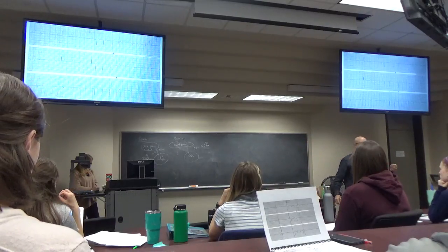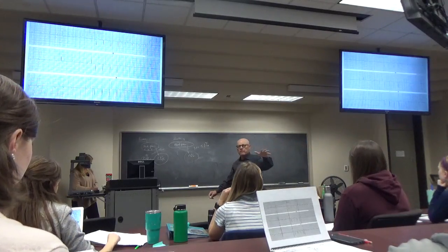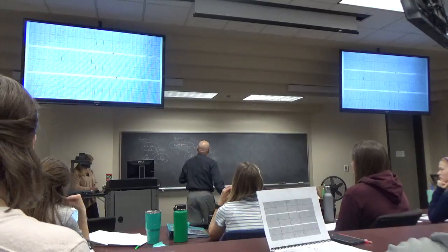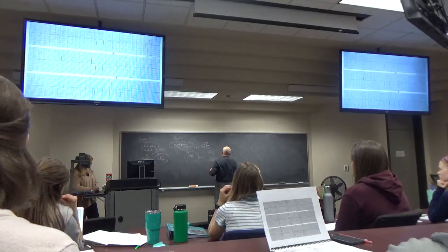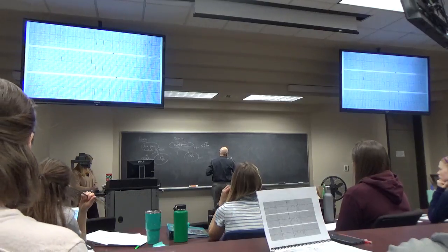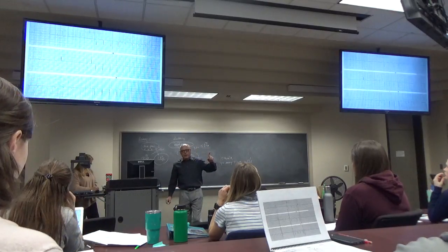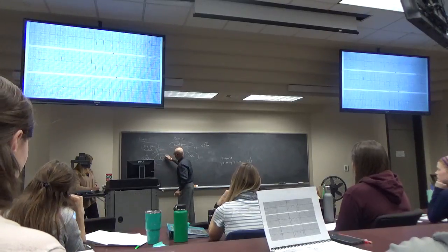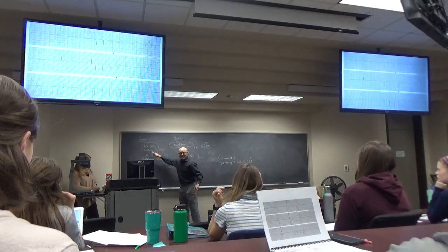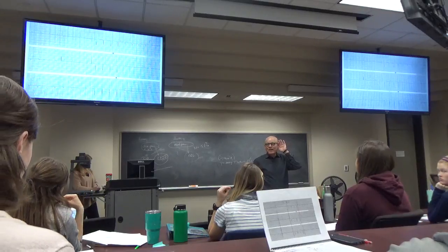How would we interpret that if they had T wave inversion and a little bit of ST segment elevation? What would we say about that? Ischemia. We might call it ischemia. We might call it primary T wave changes. Now we go from a pretest probability of 80% that the EKG is positive for ischemic changes. What's the post-test probability that this is angina? It's high. It's high.